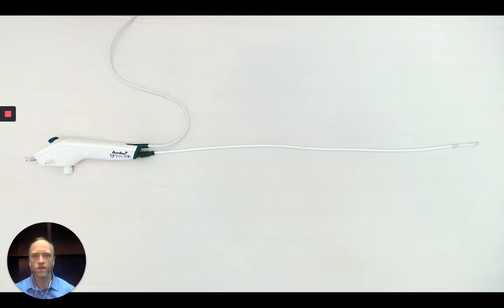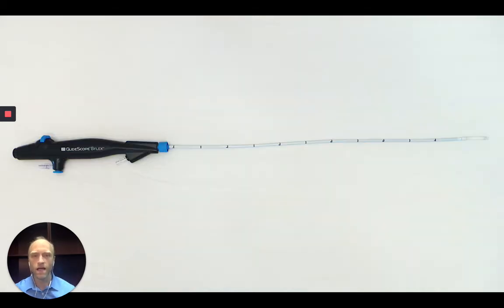In general, I prefer to use a flexible intubating endoscope, though a video scope can be used as well. The Ambu A-scope was the first disposable scope on the market. It has made it much easier to have the appropriate equipment readily available in the ED. Prior to the disposable scope, expensive fiber optic scopes were often housed in the OR, which greatly limited their availability to the emergency physician. GlideScope and Karl Storz now also make disposable scopes that are compatible with their video systems, so there are additional options on the market.